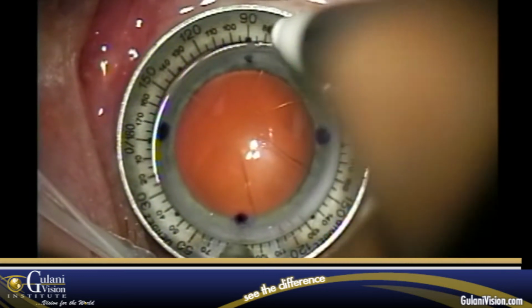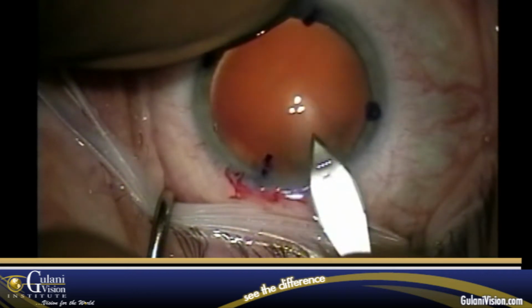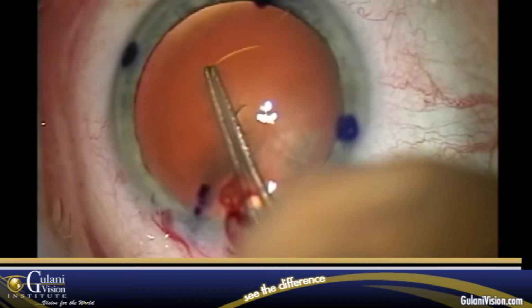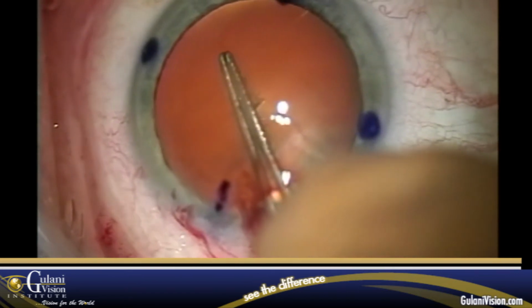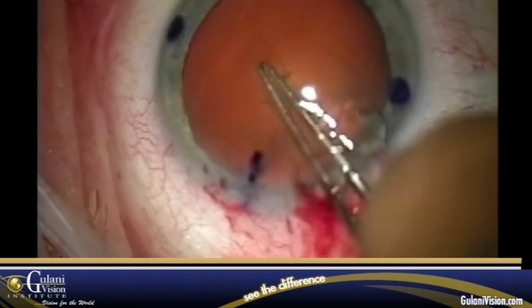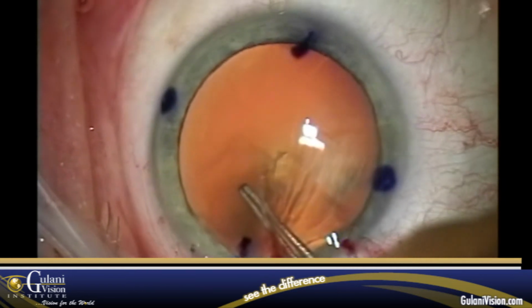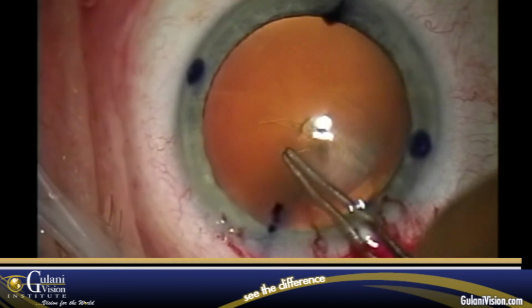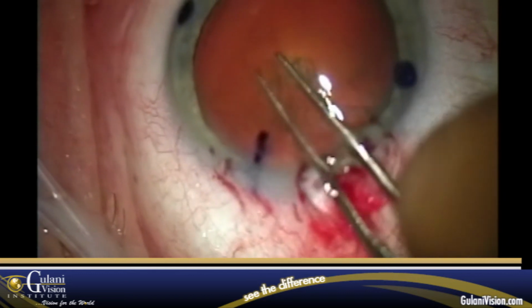In this case of prior vitreoretinal surgery with extensive macular degeneration, I follow my principles of metal blades over diamonds to keep the incision blunt. My difficulty here is the capsule is extremely friable and the lens is mobile, as well as the reflex is not that great, so I am taking my time grabbing the capsule in each quadrant to see the edge reflex, at the same time trying to maintain a tight restriction on the rhexis to not enlarge it, in this case of vitreoretinal surgery, with an extremely mobile lens and very little vitreous pressure.